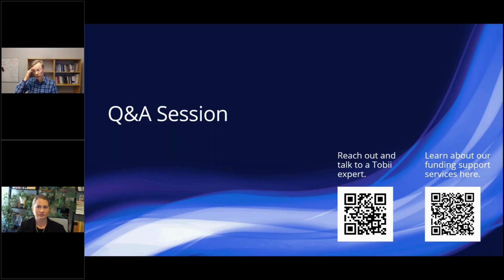Well, in terms of the algorithms, there are a few parameters that are set because there is a minimum blink amplitude, for example. So if you're interested in twitch blinks, you probably need to go into the algorithm and change the parameters a bit so it allows the detection of these tiny, tiny eyelid movements. The parameters as they are in the standard implementation on GitHub right now are tuned based upon what's most common and reasonable from previous literature.